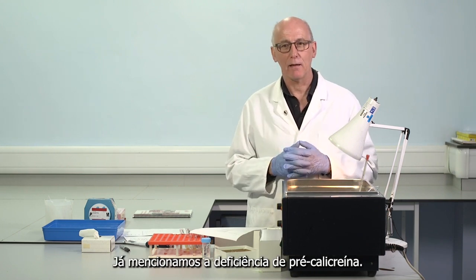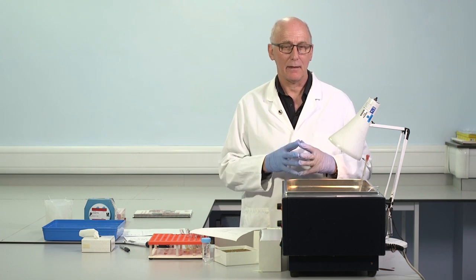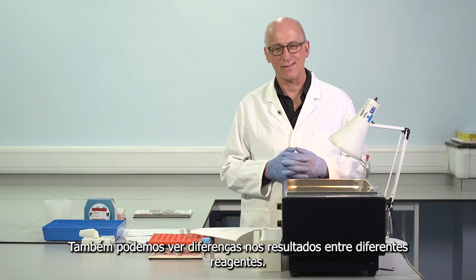We mentioned already prekallikrein deficiency, high molecular weight kininogen deficiency. We can also see differences between results with different reagents.